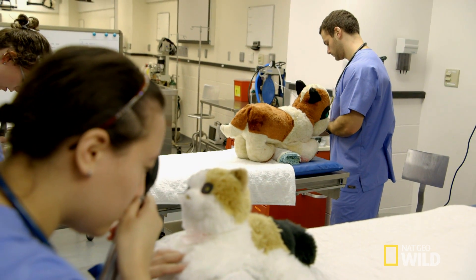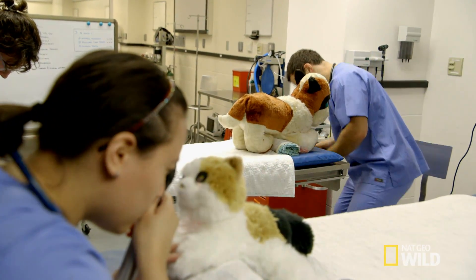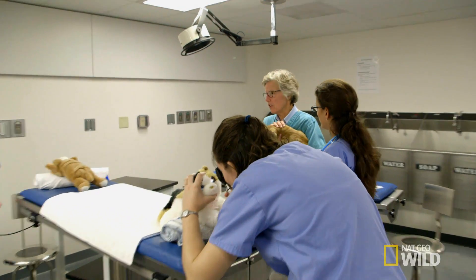Students start by using their ophthalmoscopes on animal models. This cat is almost like a stuffed animal, she's so darn good.